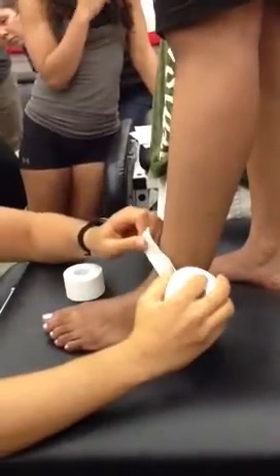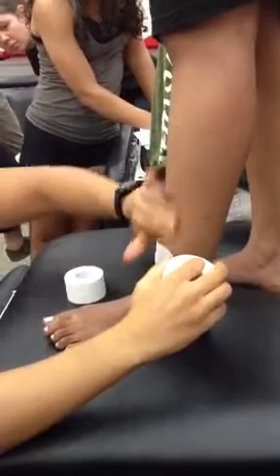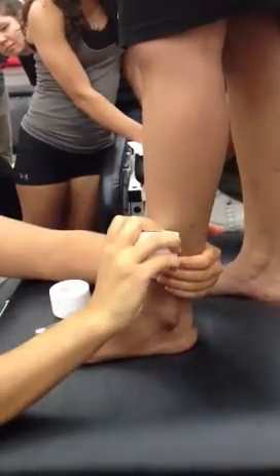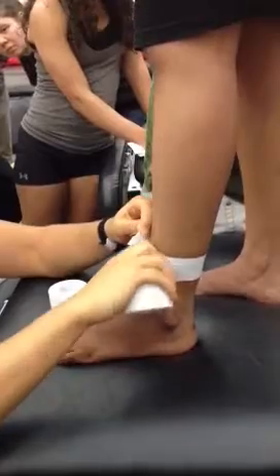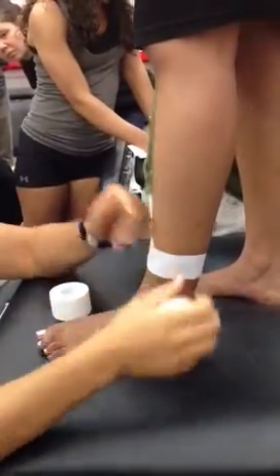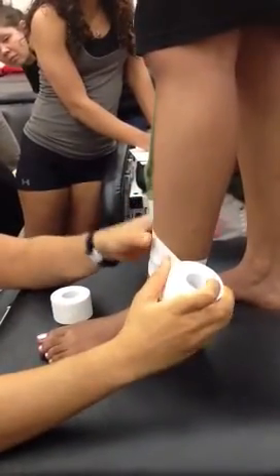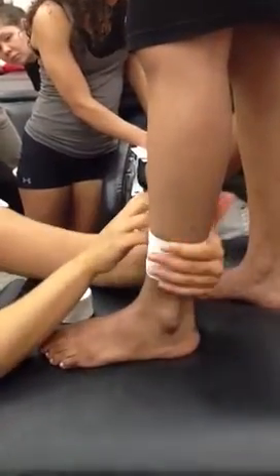So I'm going to start on the anterior side. You're a little bit lotioned — I might need another one. I'm going to hold that down because she's a little bit lotiony. I'm going to loop around. As I come around, I'm going to approximate the muscle to the bone, coming up with a bit of a diagonal. You are way too lotiony. I'm going to come again from that border of the tibia — you can feel the tibia — go around, overlapping by half. When I get to the back, I'm going to approximate up onto the bone.